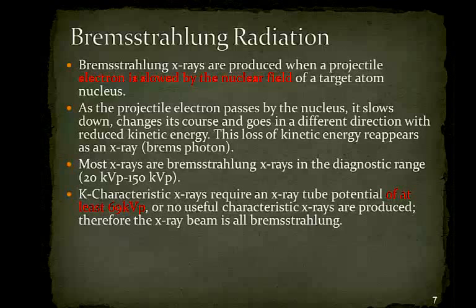have a huge variation. Because of Brems, when we talk about kVp, kilovoltage peak, we say peak because peak is the highest number. So if we said 120 kVp, as far as the push, that is going to be the highest. Theoretically, we're going to get values that are lower, because the interaction is not certain in how it's going to occur.